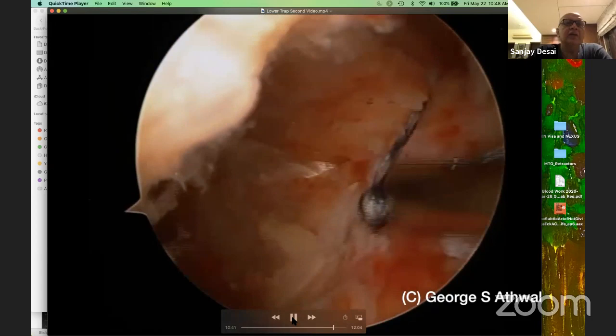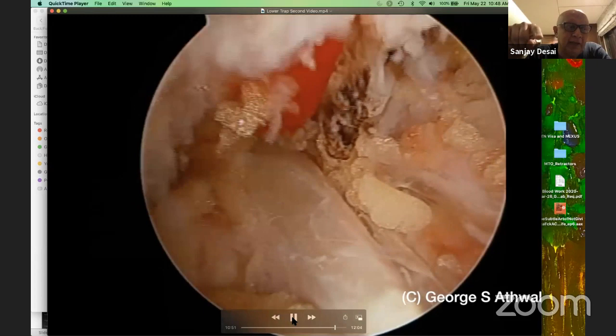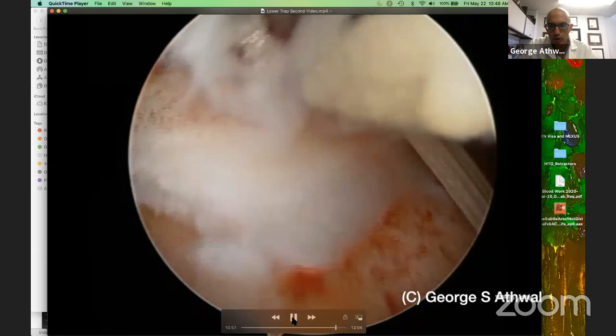I presume that you measure the length of the transosseous tunnel to decide the length of your loop. And I guess it's a fixed loop. That's right. In my hospital, unfortunately, we only have 15 and 20 millimeter loops. I wish my hospital would pay for the dynamic loop where you can shorten it and lengthen it.